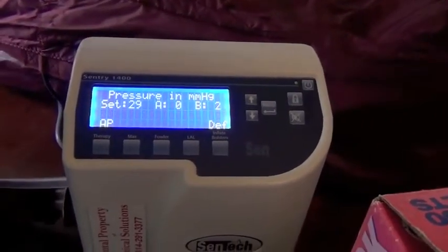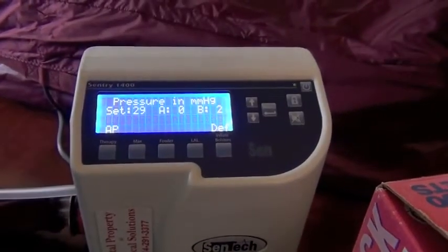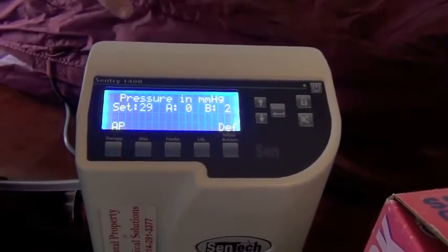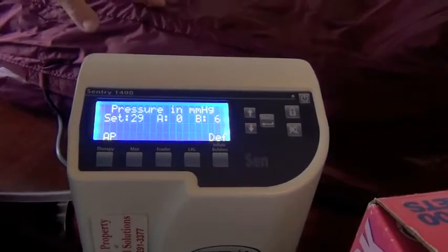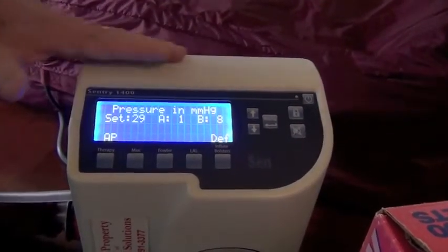You turn the unit back on, and it will assume whatever it was doing before, and it always gives priority again to these peripheral bolsters, which give the device, the mattress I should say, stability. So those will fill up before anything else does, and once they're full, then if there's any need to add air to the mattress, that follows.